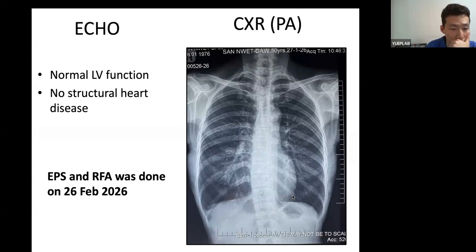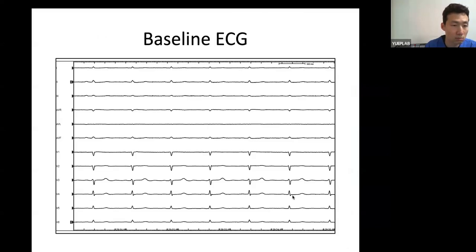Even in such a skinny chest X-ray, I should be able to see on a PA X-ray the apical portion of the left ventricle. I don't see it. It's round. You see that? Yeah, that's not a normal X-ray. Even the heart is small. Okay, you point to that pendulous heart. That's fine. Okay, next. So sinus rhythm, same thing. Delayed transition. Keep going.